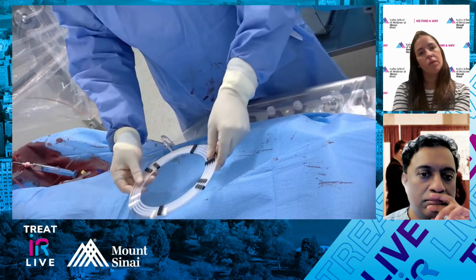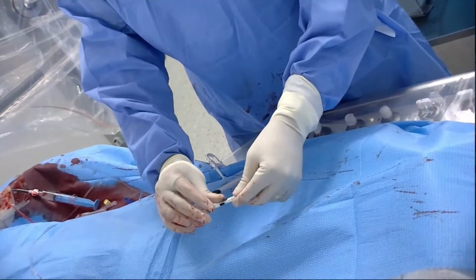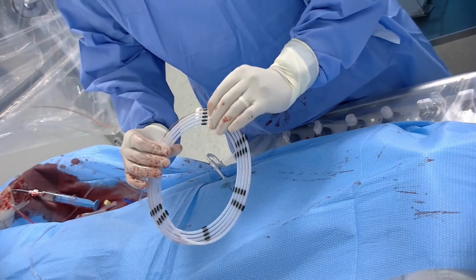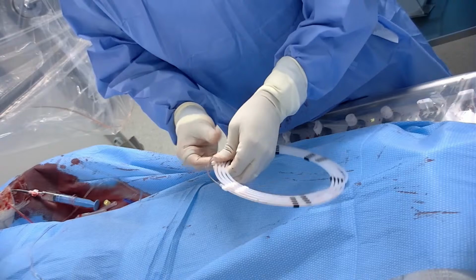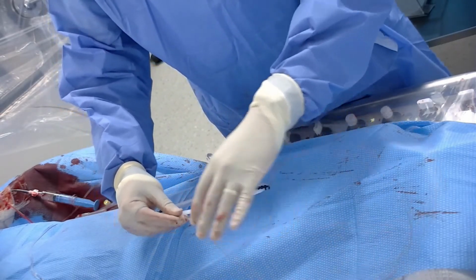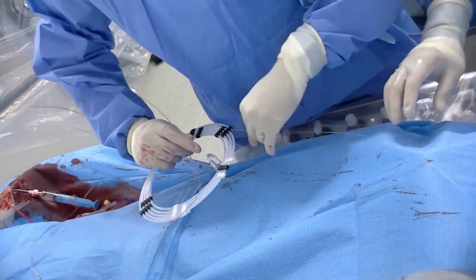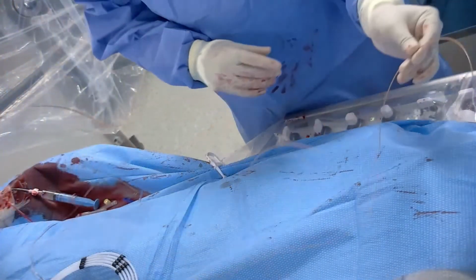So I don't know if you guys can see. This is how the coil comes. It looks exactly like their normal pod coils. The only thing is it comes out a little differently from the hoop. So we're going to unlock this. I swear to God, I can unlock this. Yeah, here we go. It comes up, and it comes out front end first. It comes in this orange casing, and then it comes out there. There's no friction lock like on the other one, so it will slide in and out. Can you just hold this for a second?